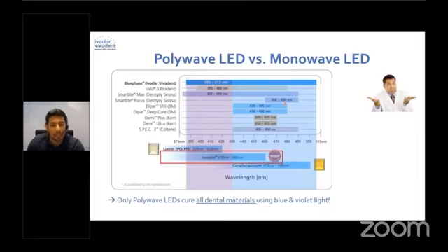So if you do have a blue phase light cure, it won't be a problem, obviously. But if you do have other light cures, I think the majority of the light cures in the market will be able to initiate the polymerization with composites that have Ivocerin. The great thing about Ivocerin also is that it is very yellow in color, but unlike camphorquinone, it actually loses its color. So you can use it for anterior direct composites or anterior composites in general, or if you're doing a veneer case, don't be concerned when you're applying it. It's going to be yellow, but once it's cured, it disappears.